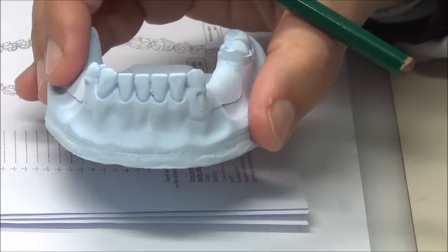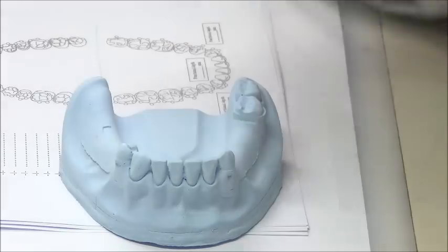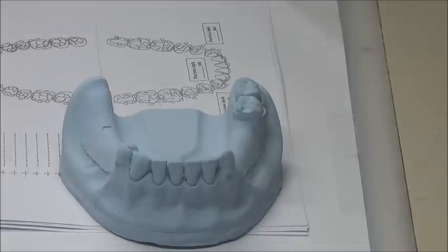It has one color. Can the technician see mobility here? On the cast, can you see mobility? Can you see bleeding and probing? Can you see fillings, especially if they are well done? So I need to scan especially the abutment teeth very well.